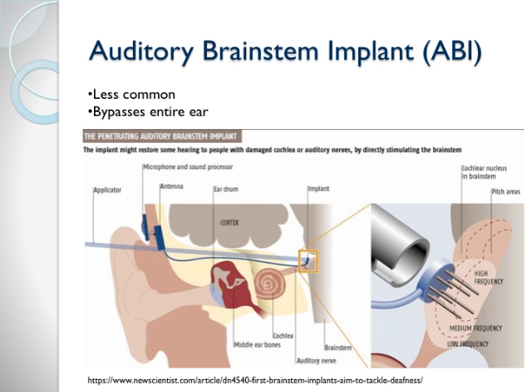So how it works, the electrode implant bypasses the entire ear system and interfaces directly to the auditory brainstem with another electrode array. This type of implant requires extensive speech therapy and time because the brain is essentially learning or relearning how to perceive sound in an unnatural manner.